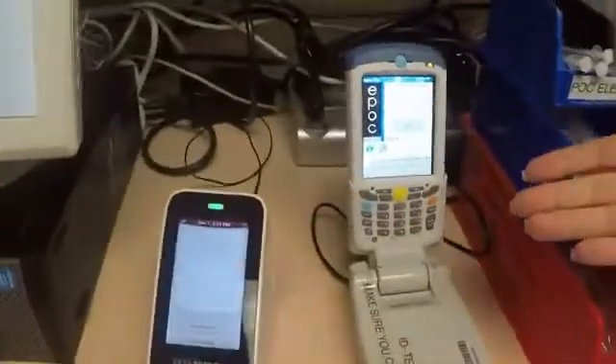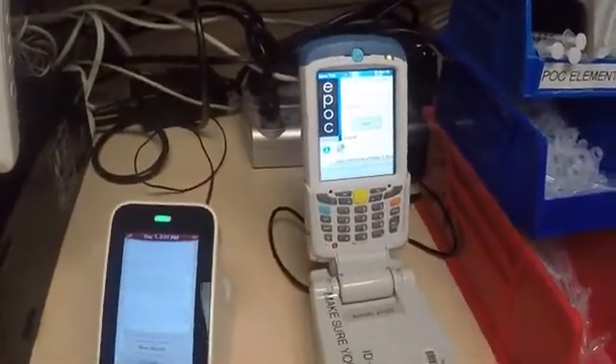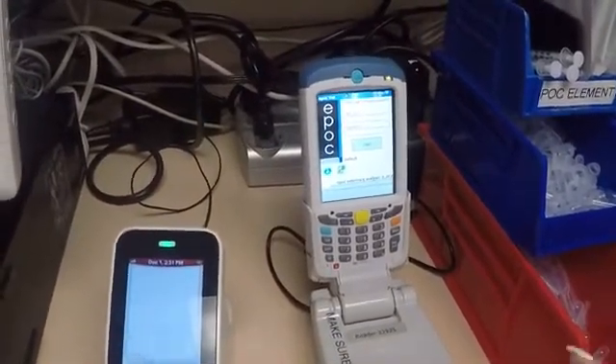Today we're going to do the EPOC training. Here's your EPOC — this is going to be the replacement for the ISTAT. This is your blood gas, electrolyte, lactate, and ionized calcium all in one cartridge.